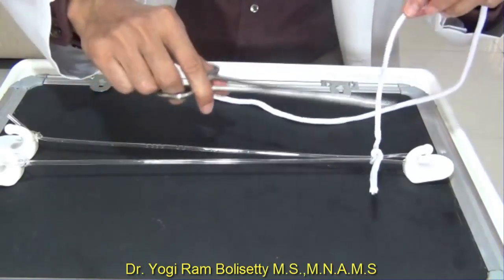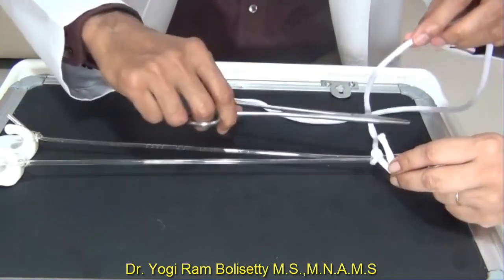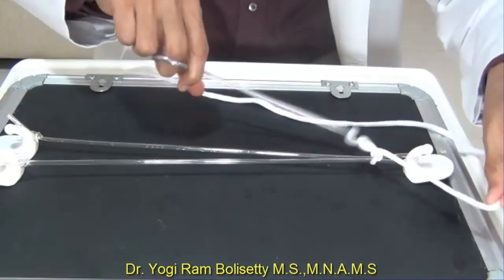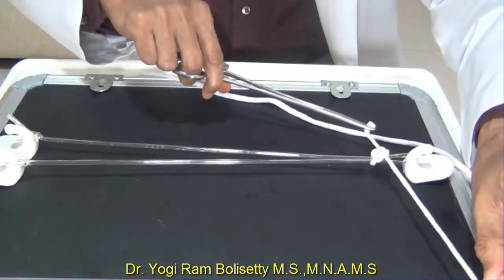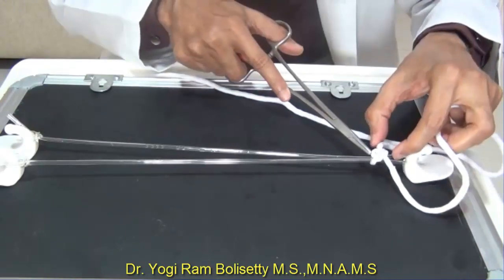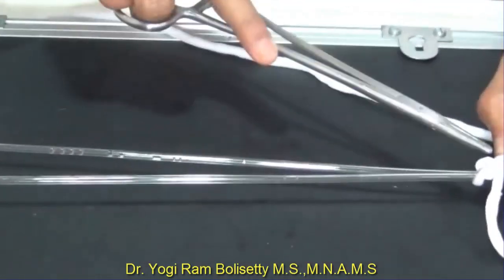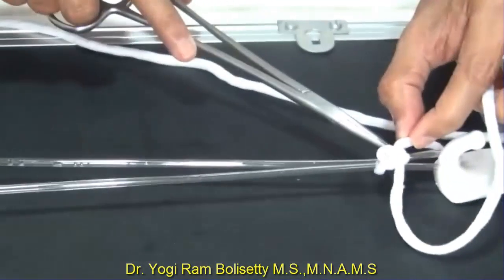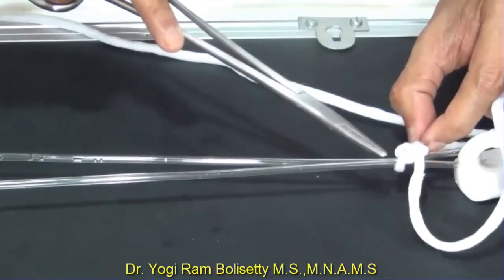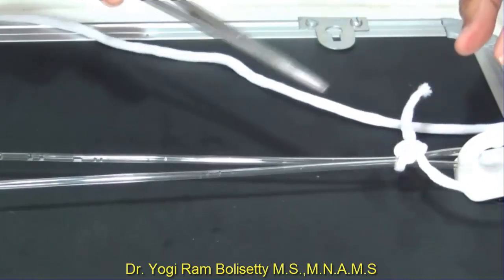For additional security, form a third throw. Again pass the needle holder into the loop, turn the long strand clockwise, hold the short strand, and form the third throw. This is the triple throw reef knot. After formation, check the knot: both strands come in front of the loop on one side and go behind on the other — confirming it is a reef knot.